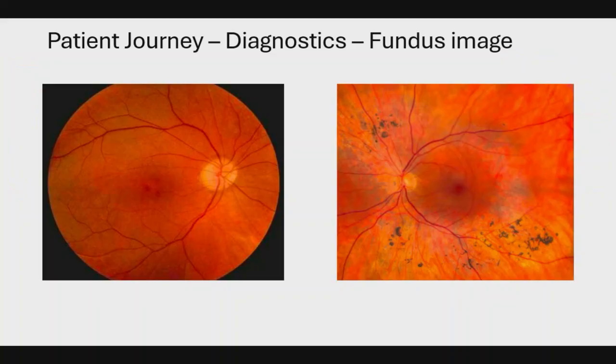And on the right side, and also on the left side, you see what is meant by a slightly pale optic nerve head. Here on this screen, actually, you can see it slightly better. And usually, you always compare the 2 eyes. It may be asymmetric.